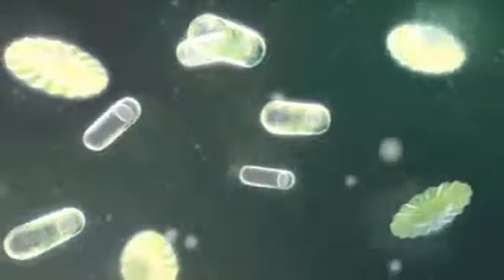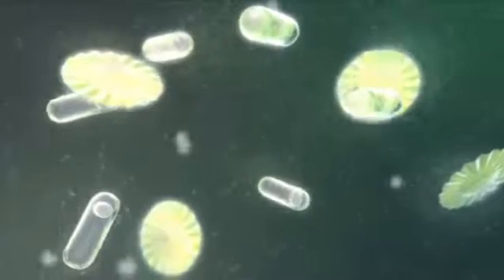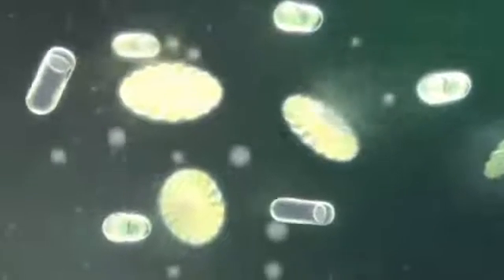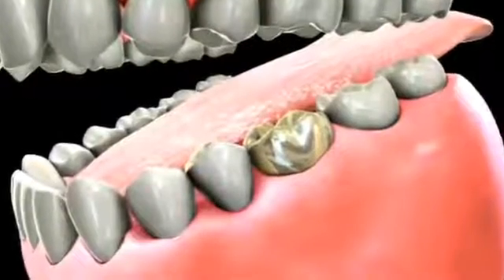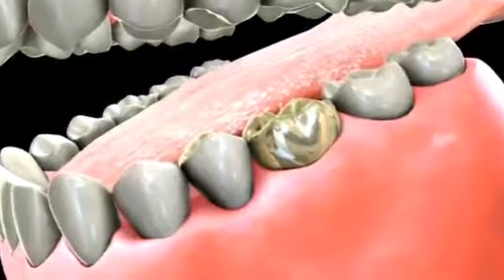Keep in mind, fit is an important factor in sealing out the bacteria that tries to get between the bridge and the tooth, possibly causing decay and premature failure of the bridge. In addition, gold tends to limit sensitivity or discoloration of the teeth or gums around the bridge, compared to non-precious metals.